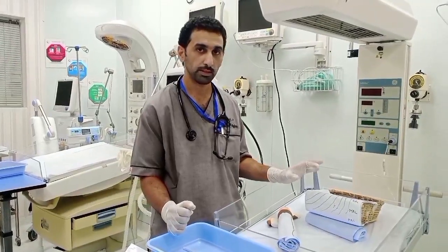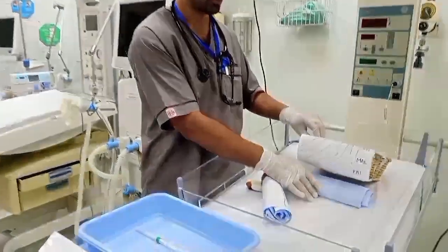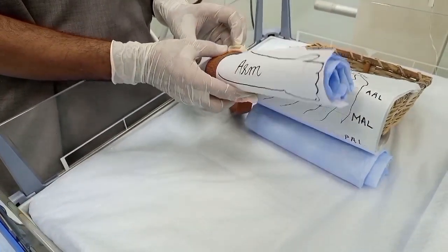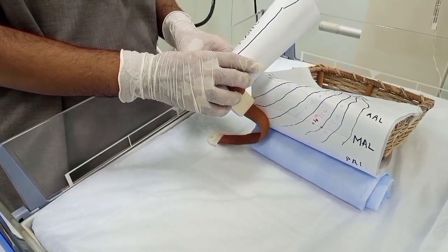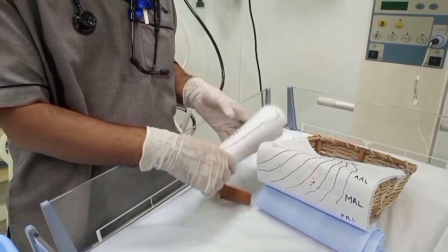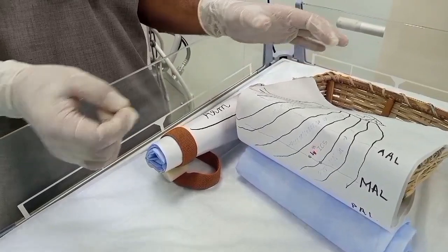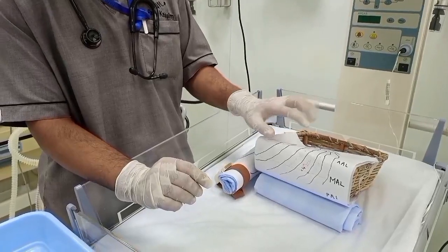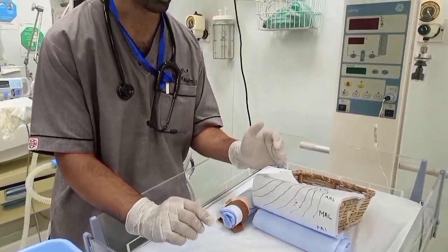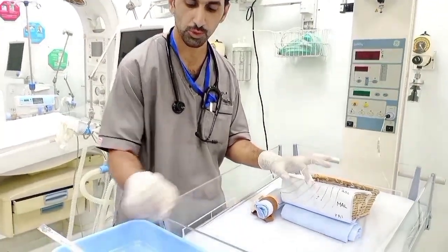After identifying the site of insertion, position your patient with a roll below the affected side of the chest and the arm positioned above the head, internally rotated. Apply antiseptic solution and anesthetize the area using one percent lidocaine. Identify the fourth intercostal space, which is the desired location of insertion — you can also insert into the fifth, but we typically use the fourth intercostal space in neonates.